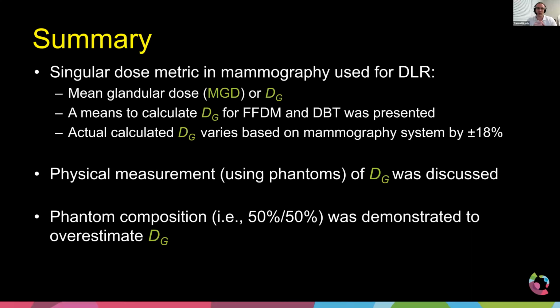So if you are making your measurements and you are right at the threshold or maybe a little bit above, you need to dial that down, because that 18% threshold can go both ways. If you're below that value, but barely close to it, say this is the threshold and you're just right below, remember that plus 18 can actually push you a little higher. So you may still ask yourself, can I go a little lower? But once again, everything is always based on looking at the image quality.